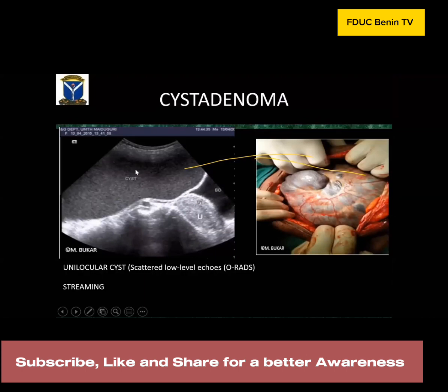You can see the contents, low-level echoes within the cyst wall. But you can see that it's unilocular. So it's not all the time that mucinous cysts are always multilocular. This is a mucinous cyst that is unilocular. So you can also have serous cysts that are multilocular.